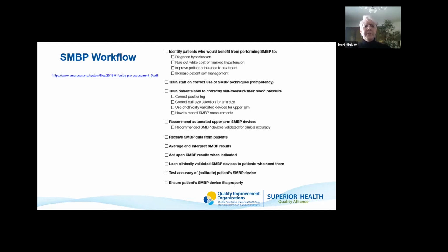Make sure you're training your staff on the correct use of SMBP techniques, and then checking their competencies, so not just training, but also having them test out on it. Train your patients on how to correctly self-measure their blood pressure. Again, show them how to do it, do the teach back so that they know that they're doing the correct procedure at home. You can recommend automated upper arm SMBP devices too, if that is easier for the patient.